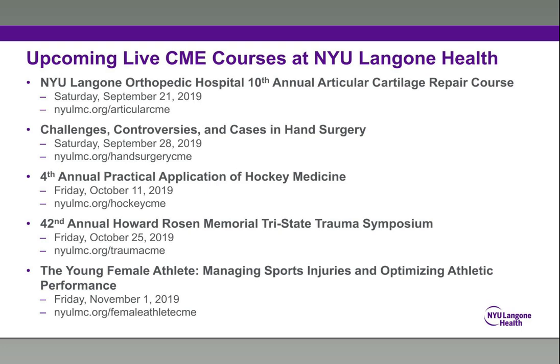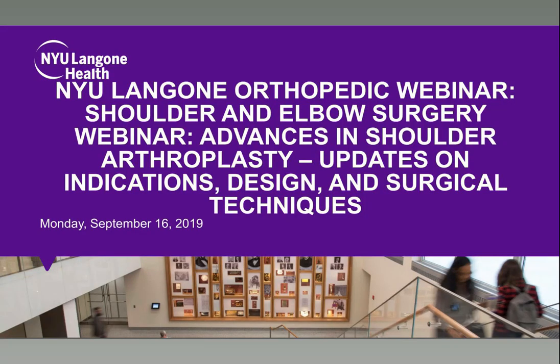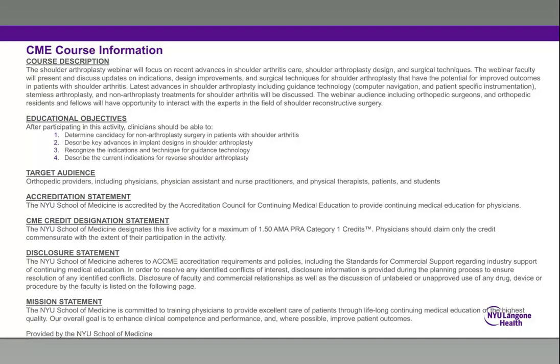So there's a question for me. How do you decide intra-op or pre-op if you're going to use a short stem or a stemless implant? That's a great question. And as I pointed out in my slides, I typically tend to use a stemless device in anatomic replacements in young males who have good bone stock. The way I try to figure it out, and I don't think it's an absolute science, is what is called a thumb test. I can't recollect who described it, but I did not figure this out.